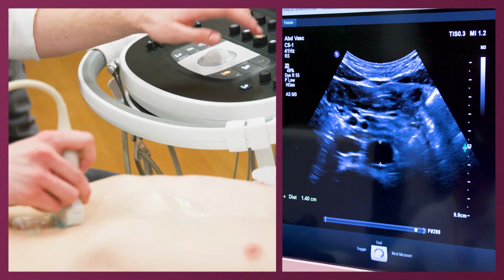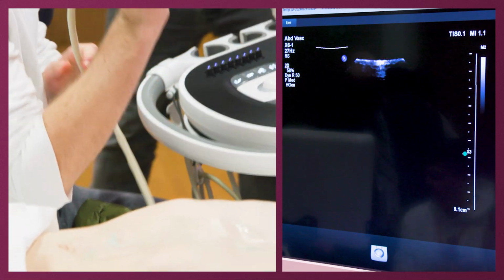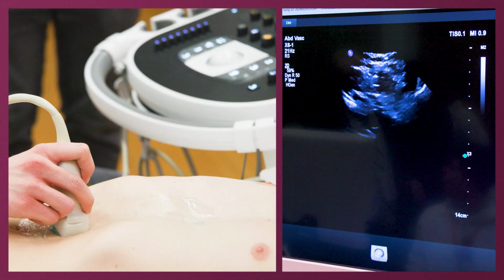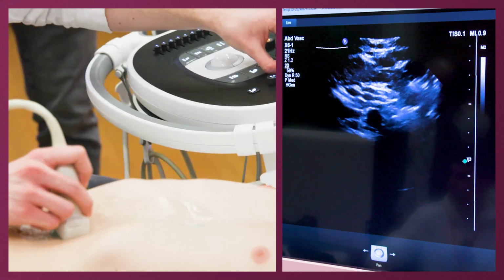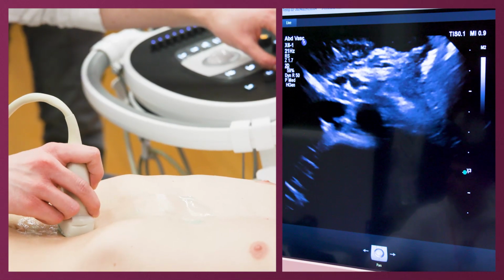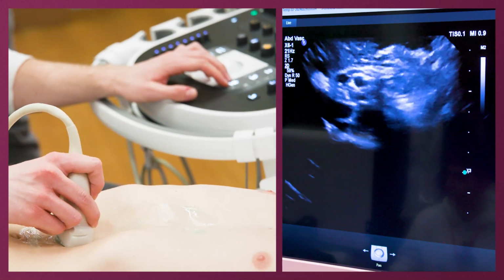The same. Let's check it with the 3D. Then you select this one and make sure that it starts in abdominal vascular. If you don't start in abdominal vascular, you will not find the AAA app, because we can only reconstruct it there. Is there also a lateral approach, if someone is overweight and has lots of air in the bowel? Yes, you can do that. Sometimes we do. It's not that often needed.